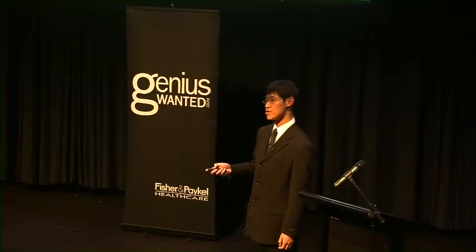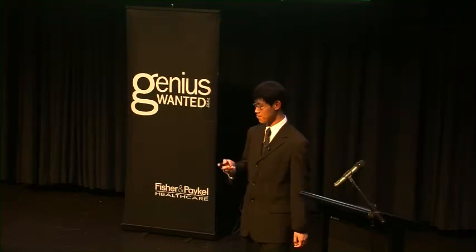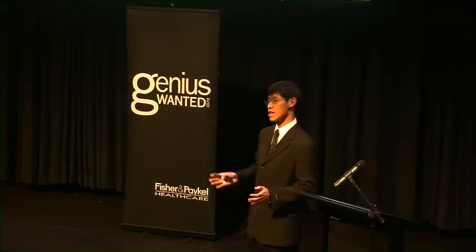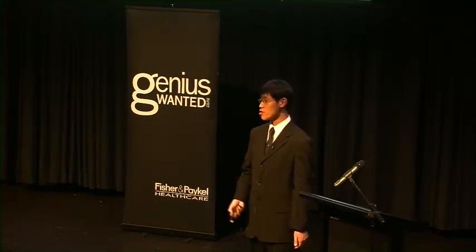The way to approach this is to first measure the background phase in all 3 dimensions of space and time. And this would involve running scans that sample the background phase at different slice orientations. We then fit this data to a model, and this would allow us to predict the background phase for any scan sequence. So how do we measure background phase?